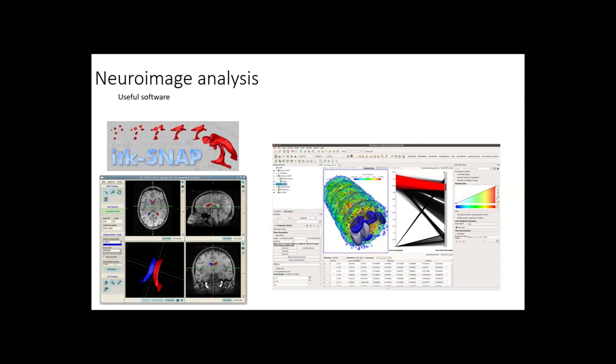Today I don't have time to cover the surface, so we're going to give you another surface file. Basically, when you open the brain, you look at this kind of surface. We cannot see into the brain, but we can see the surface. ParaView is another software that can display the brain surface. We will give you 2 surface files. You can load them into the software and play around, and this is how the brain looks in the computer.